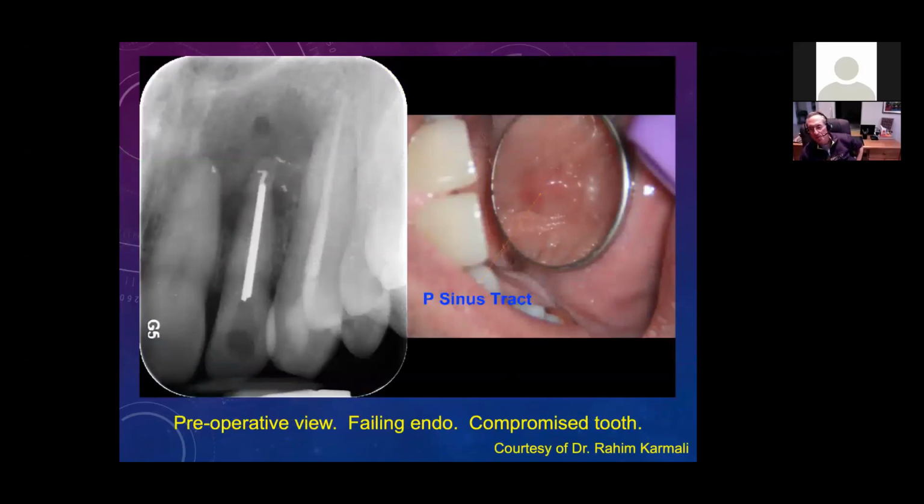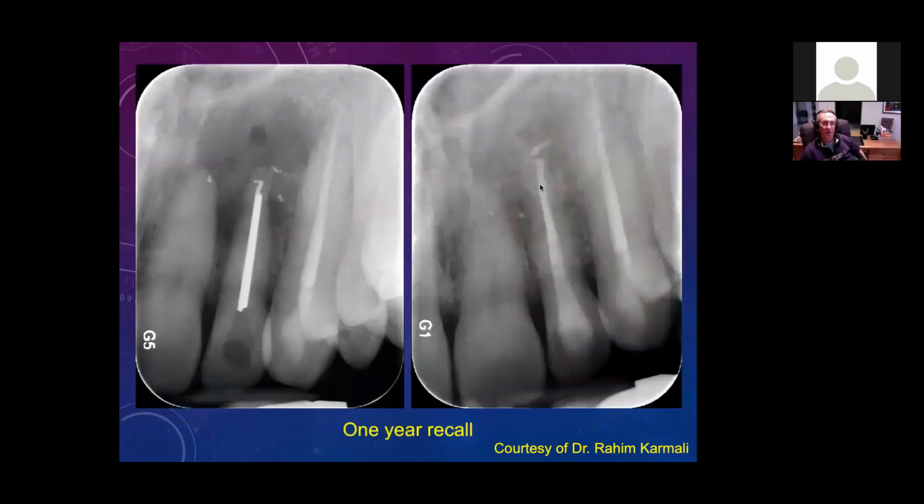When I talk to groups of implant surgeons, a lot of them have the idea that when you get these large radiolucencies that they won't heal just with endodontic treatment. And that's true in some cases, but I put in a few cases showing where that wasn't true, or we've got some post-op scans. So this is an example of that.